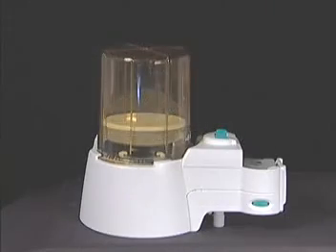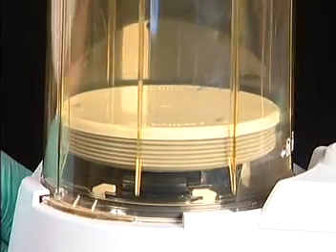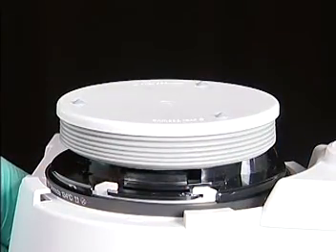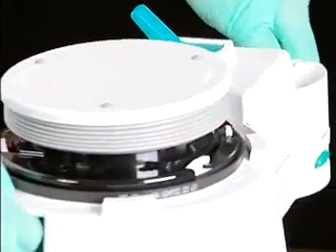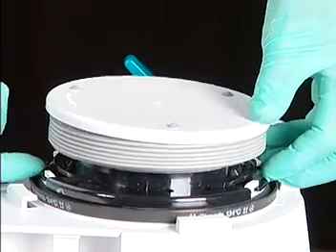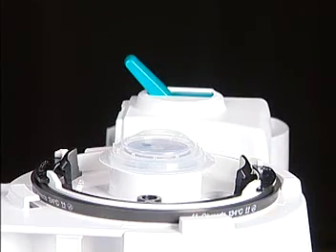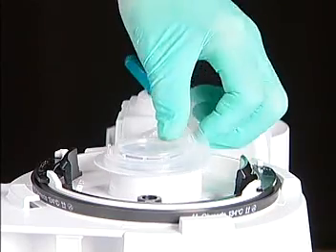Should you wish to disassemble the bellows, turn the bellows canister counterclockwise and remove. Then squeeze the locking ring on two sides to release the bellows. Finally, remove the valve under the bellows.